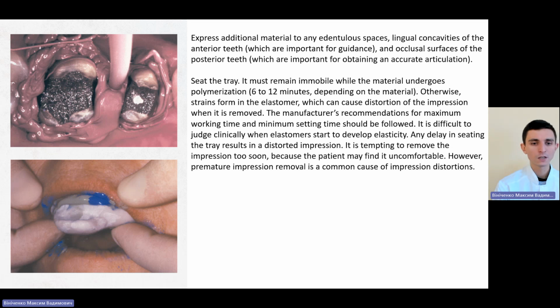It is tempting to remove the impression too soon because the patient may find it uncomfortable. However, premature impression removal is a common cause of impression distortions.